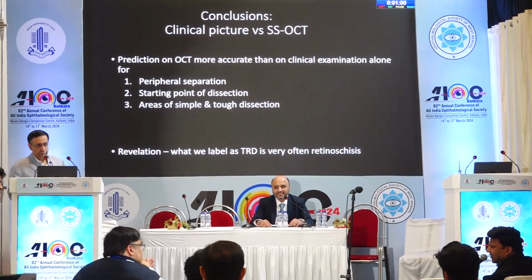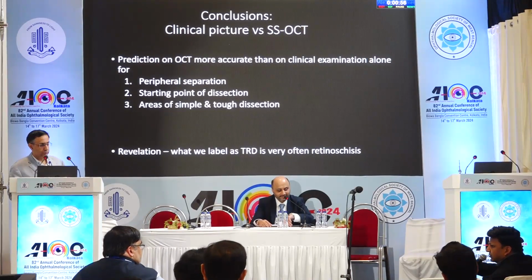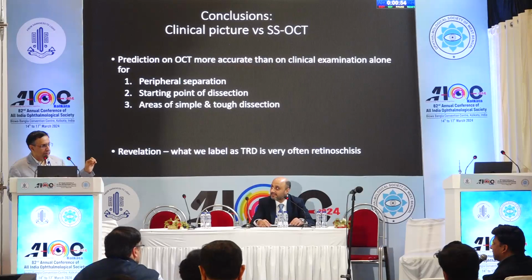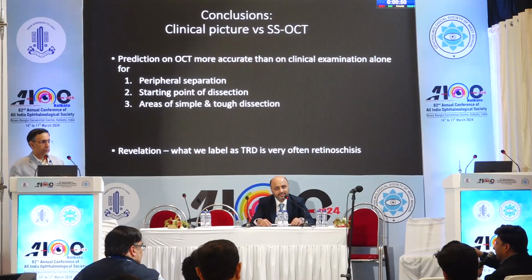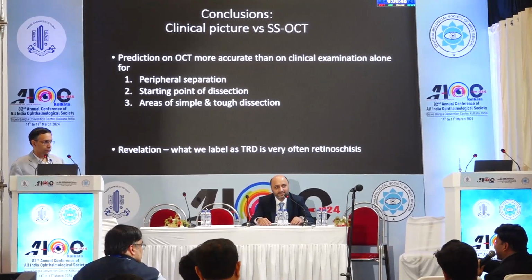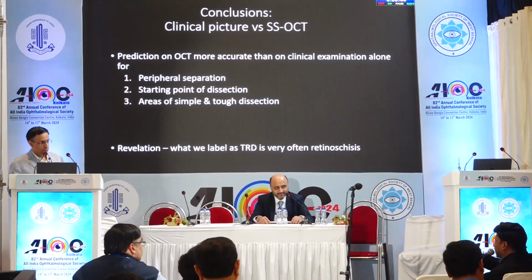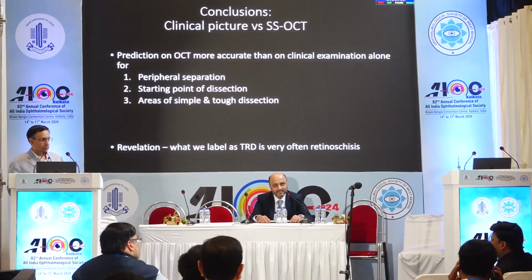Yes. It can happen. I've seen it even in a younger age group, where it's more common. And the sheen also is there, sir? The shine is also there. Once you start exploring it, you'll see that it is getting taut, and it is very adherent. It does not come off so easily. It may even cause breaks while you are peeling.